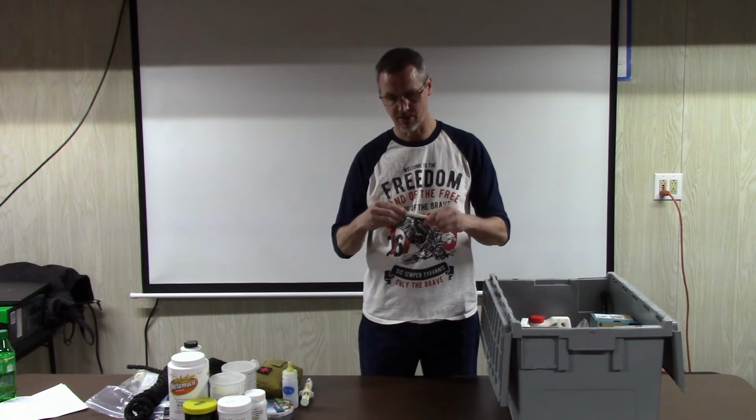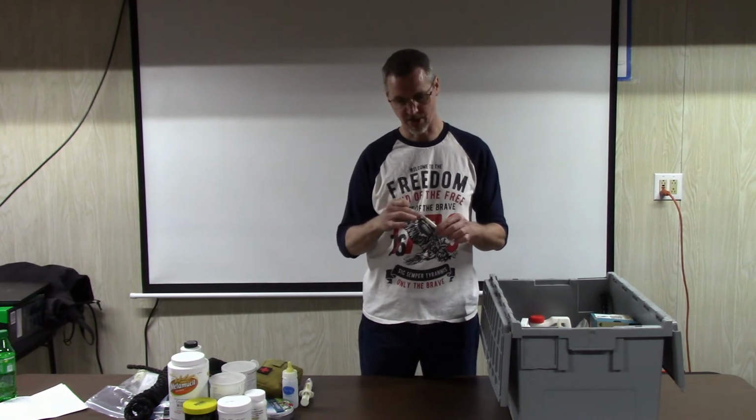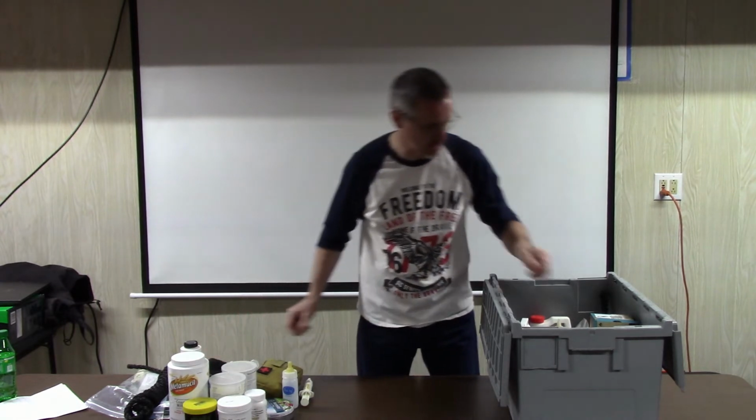This is a thermometer for the horse. If you ever wondered how to take a horse's temperature, it unscrews. If this was a human one, it would be red because of where it goes. And since it goes in a horse, you have to have something to keep it from disappearing in the horse. So this little ring's on there to retrieve it when necessary. That's a thermometer for the horses.